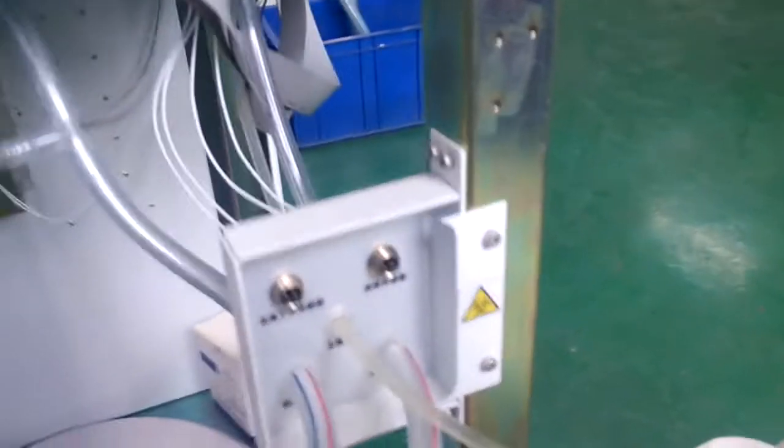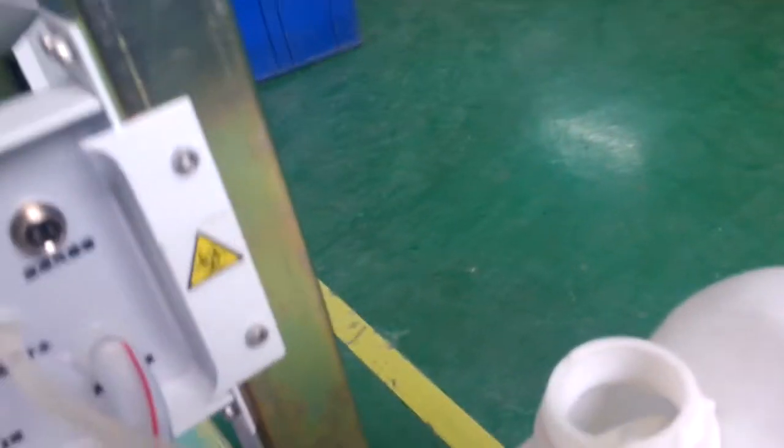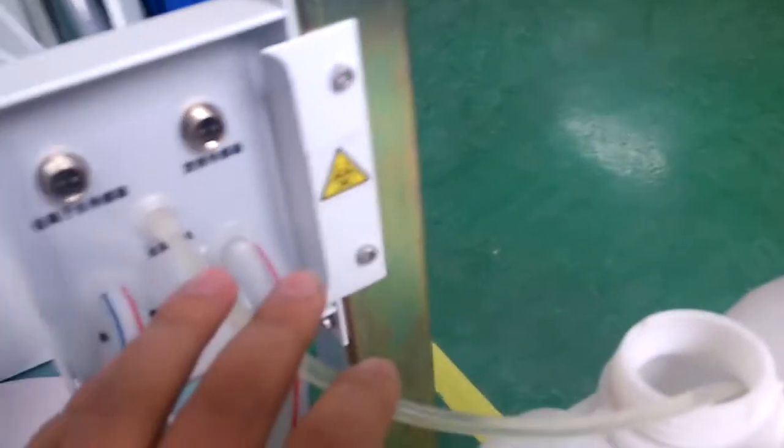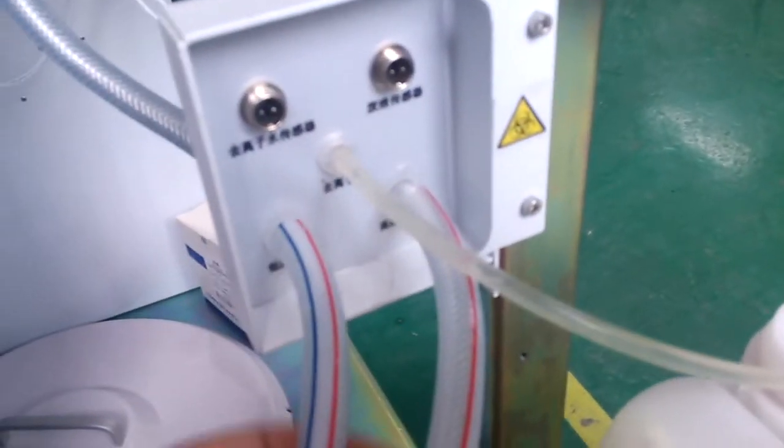In the installation, we should find the water connection. Over here, you can find these tubes in the accessory box.